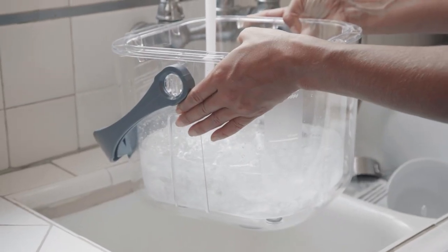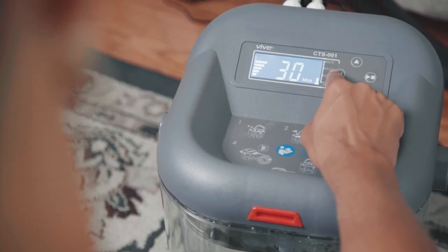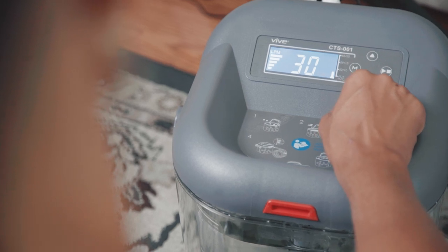the therapy machine also features five rates of continuous flow with cycle times of 30 minutes or less for a personalized experience.